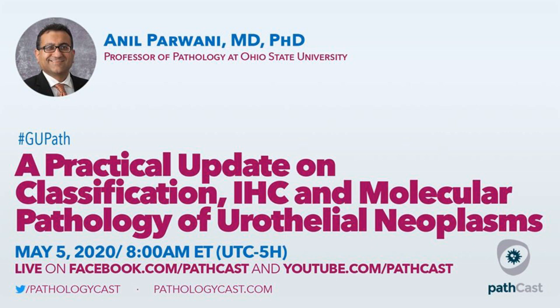Right. So another question, let me read it out. How often does a prostate adenocarcinoma infiltrate the bladder and require an immunomarker? So it's fairly common. Of all the cystoprostatectomy specimens that I review, about 25% will have incidental prostate cancer.